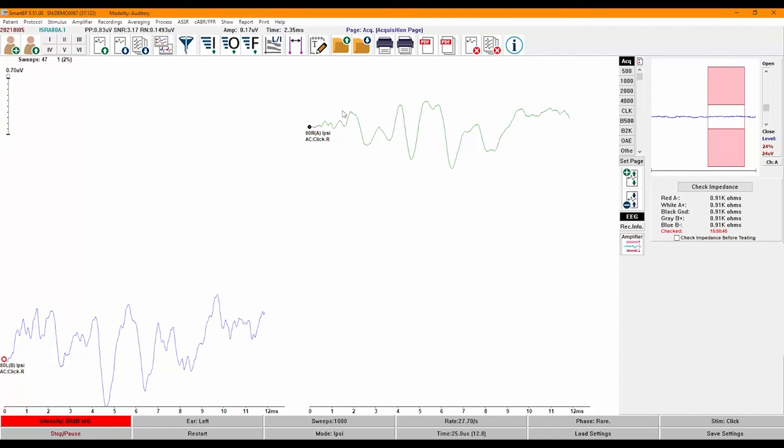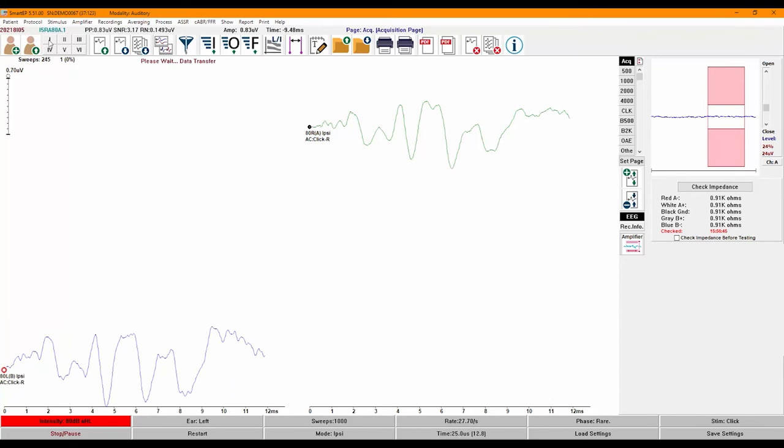To mark the peaks, first make sure the waveform you're trying to label is selected — selected waveforms are green in color. Click on the label for the peak you are trying to mark, then click right above or below the waveform where you would like to place it. Once the peak label is placed, you will notice there are two triangles: one at the top facing down (the latency marker) and the other at the bottom facing up (the amplitude marker). You can adjust the position of either marker by clicking and dragging or using the keyboard.